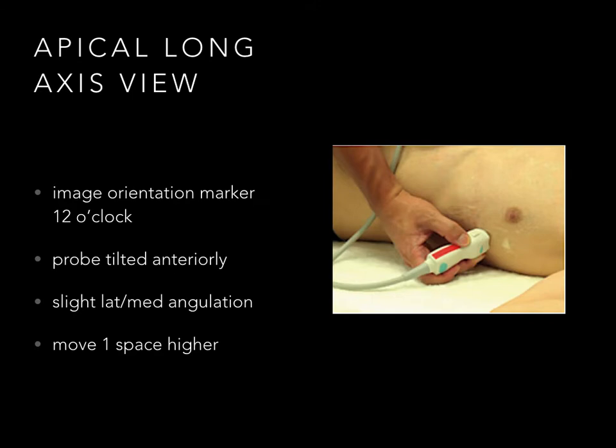For the apical long axis view, the probe stays in the same position, but we have to further rotate it counterclockwise into the 12 o'clock position.